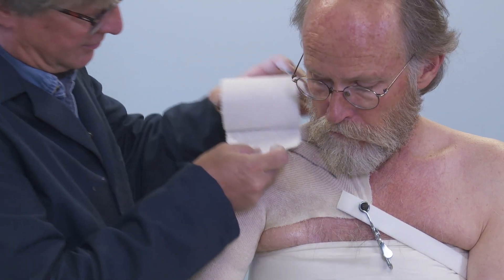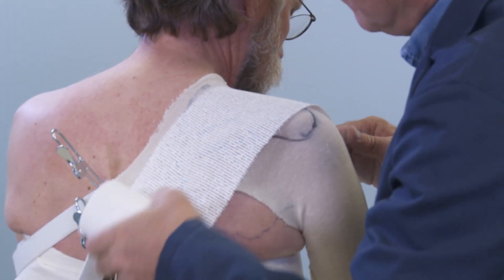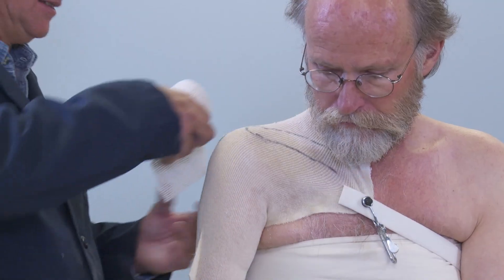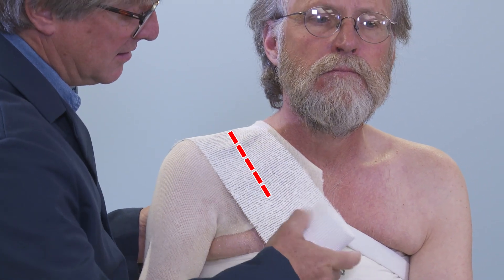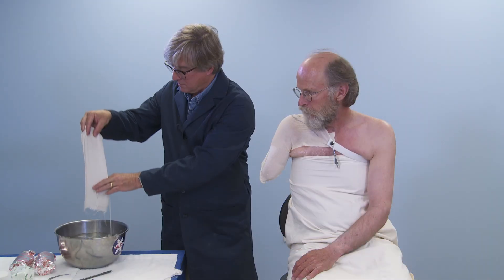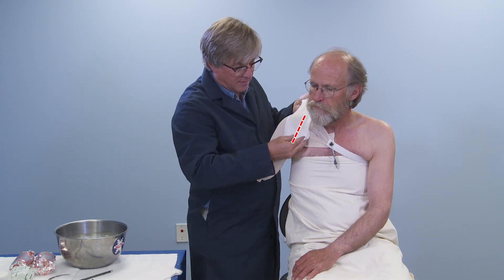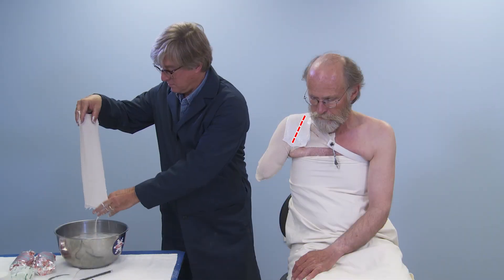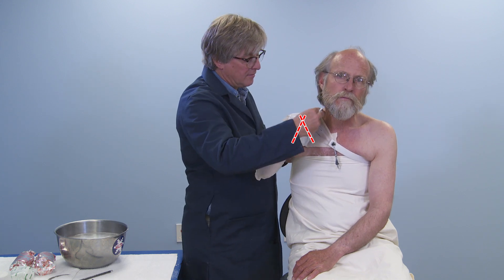Measure one splint beginning just superior to the pectoralis tendon, crosswise over the shoulder to the scapula. Make the splint using 5-6 layers of bandage. Measure a second splint from the latissimus dorsi, crossing the opposite direction over the shoulder and clavicle, beyond the head of the humerus. Wet the first splint and lay it in place. Wet the second splint and criss-cross the first, making sure to encompass the shoulder and the entire scapula.